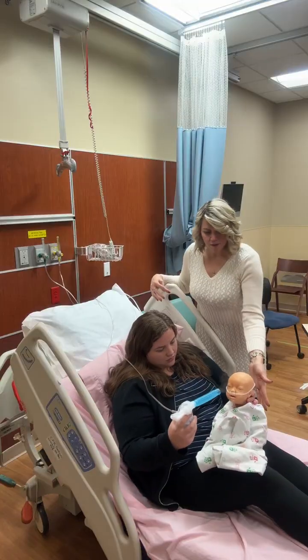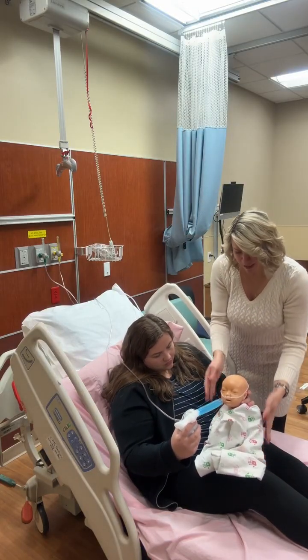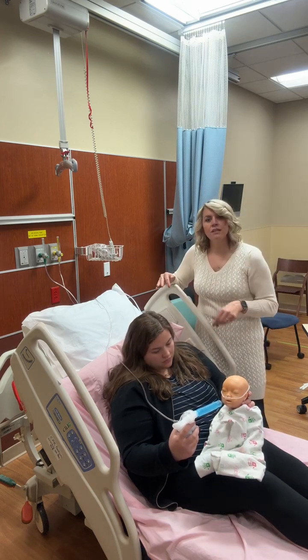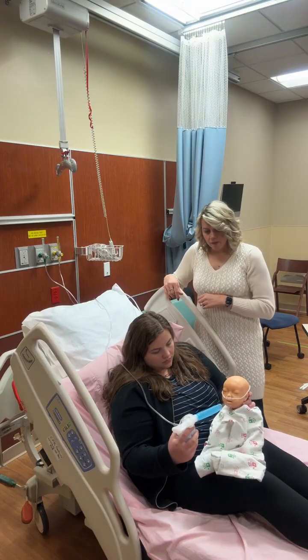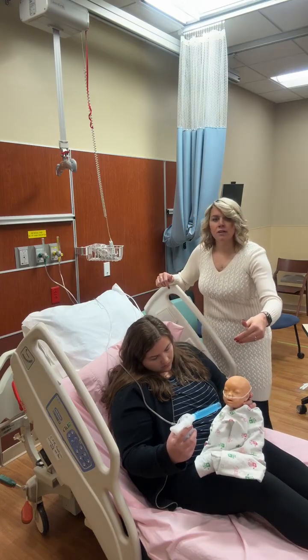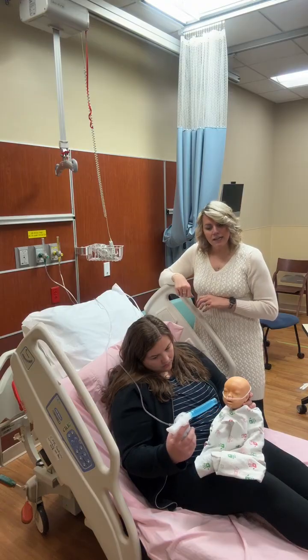Yep, and if you have to help your patients by repositioning the baby, you just want to make sure that it's up. And the mom or whoever can hold the nebulizer in front of the baby for the entirety of the treatment. And at this time, we're basically listening. If baby coughs, we can get to the mouth and the nasal passages really fast. We can use a bulb syringe to get it out.